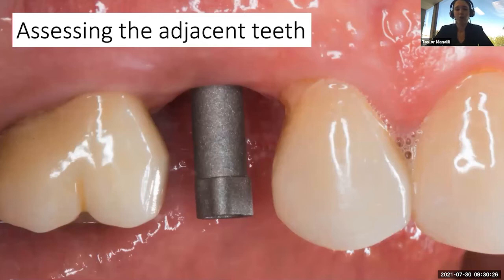Okay, I'm going to walk you through a little bit of how I go through this. Another thing I always love to do, with conventional or digital workflows, but one of the things I love about a digital workflow is it's so easy to visualize this, easier than ever before. Sometimes we miss things when we're looking at it in our mirror. It's a different perspective.